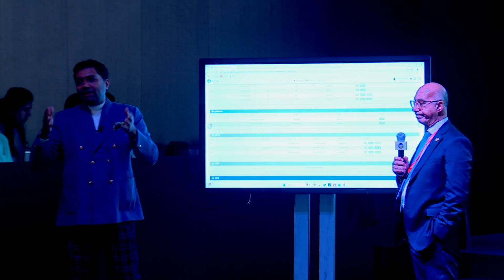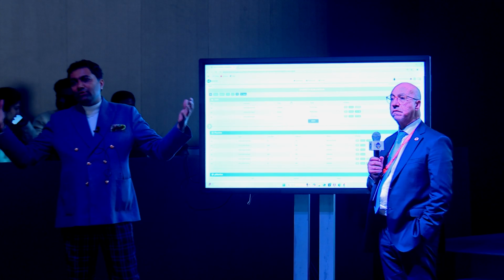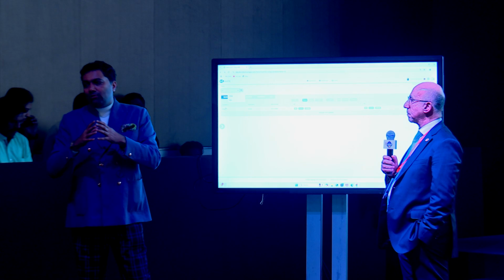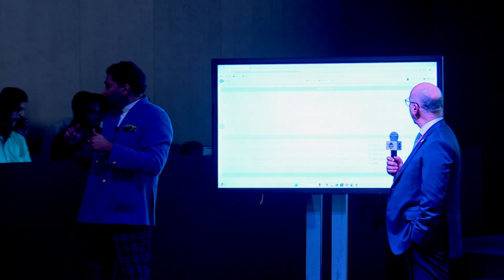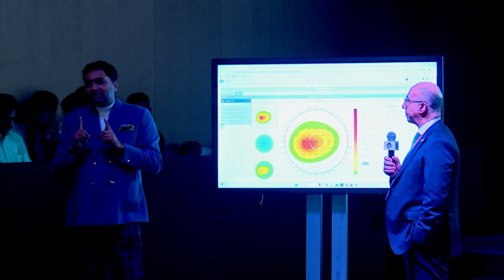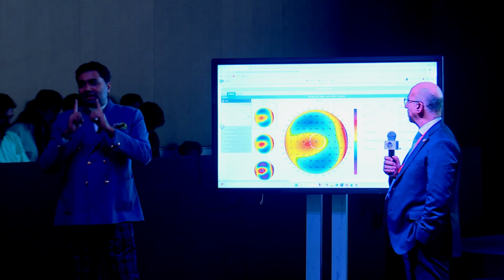That's very important because we have all been used to dealing with an optical zone which is arbitrary. Oh, I have a pupil size of 5, I will use 7. If I have a pupil size of 7, I use 10. So there is no end to it. In India we have very small pupils, but we don't know what their ideal pupil size is. So this takes how many minutes? The whole pupillometry takes 6 to 8 minutes, which I'm very happy with because it gives you a true pupil size for every single patient.